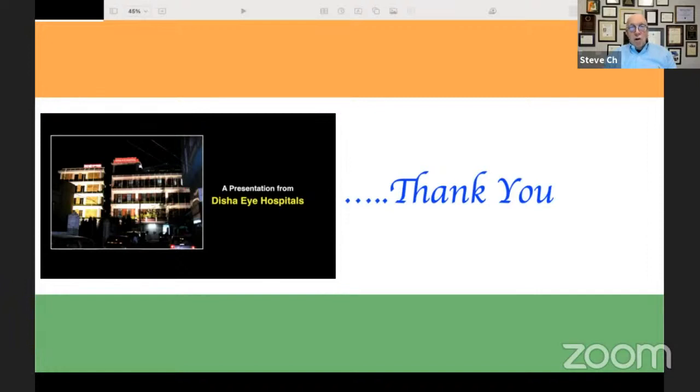The second point is I've heard that others who have done the procedure you outlined have a fair incidence of PVR. Carl Claes is an excellent surgeon, who carries the retinectomy all the way to the ora like you did, and he states, and he's honest, that he has less PVR than if you make the retinectomy somewhat more posterior. But again, magnificent surgery. The long-term visual outcomes are the question.